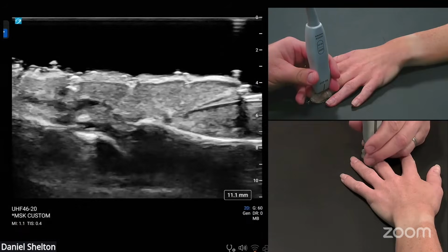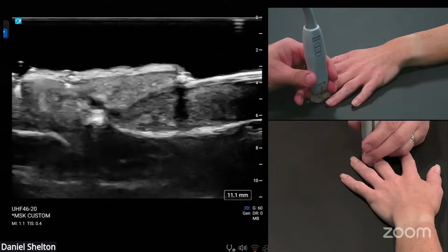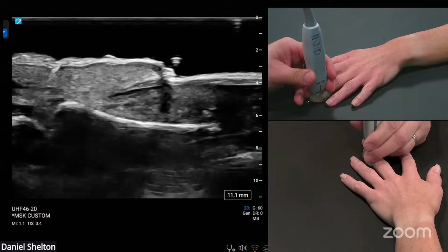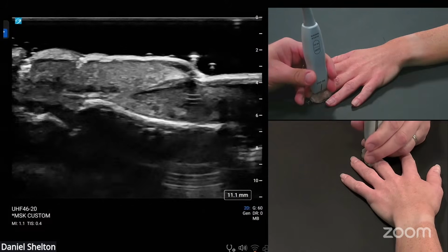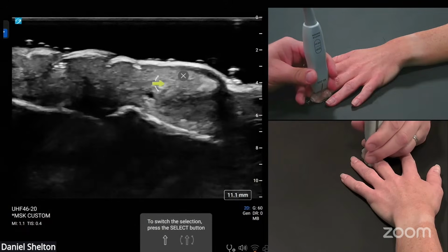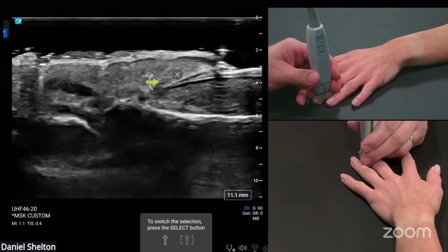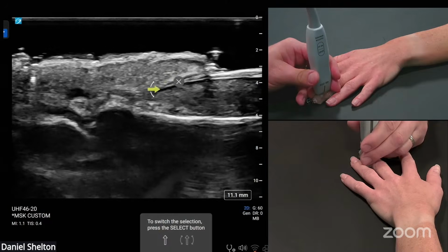And here we can see a very clean image of that nail root and the nail plate. Again, you want to be 90 degrees to the surface where you won't catch those echoes reflecting back, really nice, but really, really nice nail root. And then it's not so hypoechoic anymore, but we do have a set of fibers here that we're looking at cross-sectionally that encompass that nail root.